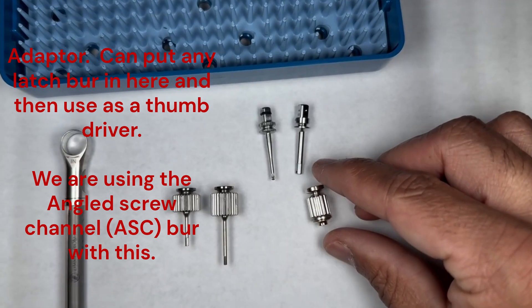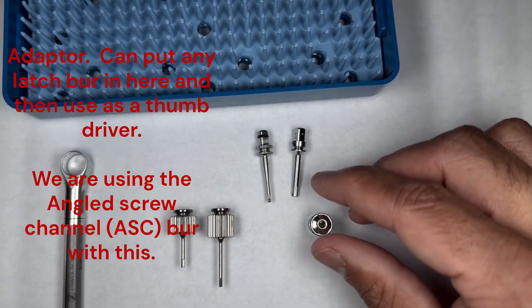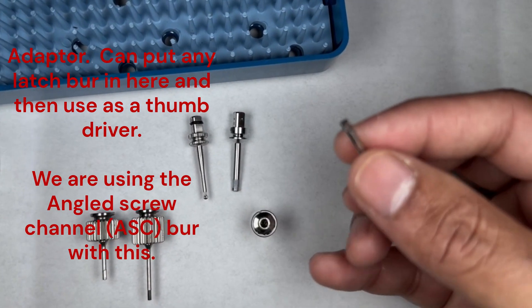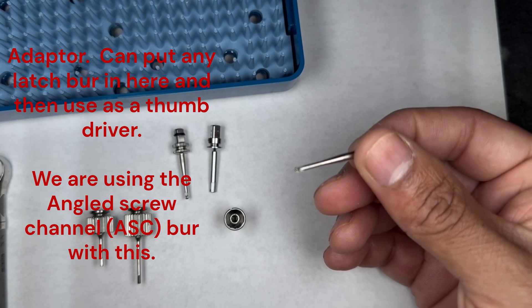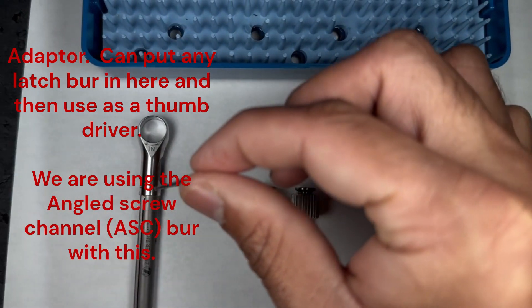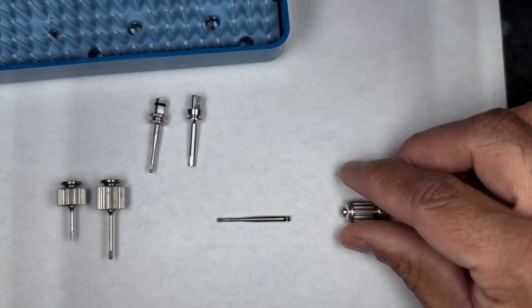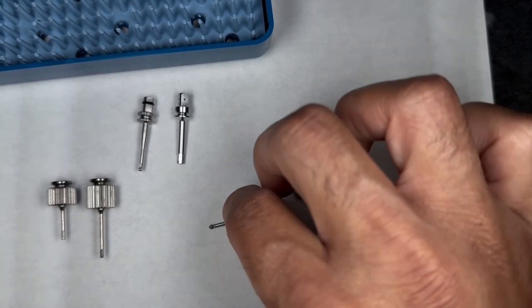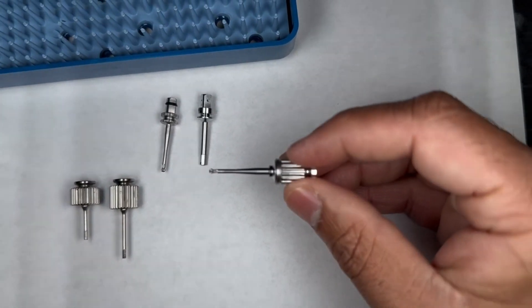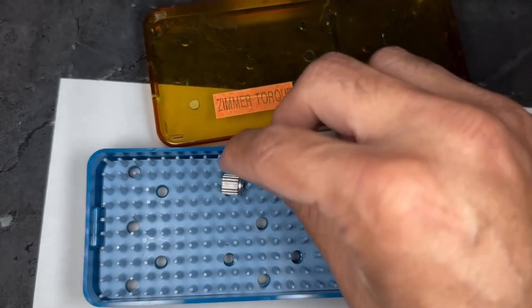To make this kit more efficient, they include these connection pieces. There's one that converts a driver into a thumb driver, and the piece that pairs with that has a ball end — so it works at an angle, similar to the angled screw channel. It goes into the torque wrench, or with the connector piece it becomes a thumb driver as well. There are two separate pieces for this — don't ask me why they designed it that way.